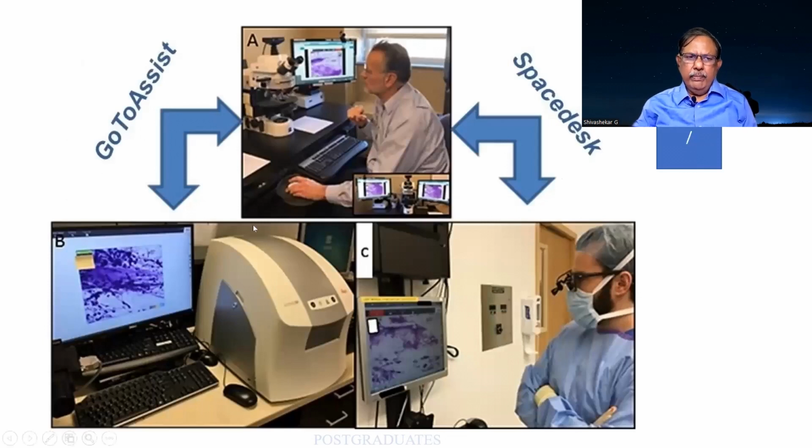So it is as simple as this. So there is an image that is being captured and he gives the instructions, it goes on to another person. Finally, they give an opinion and sometimes it can be visualized from the theater also so that they have an idea of it. So this is the advantage of the digital imaging.